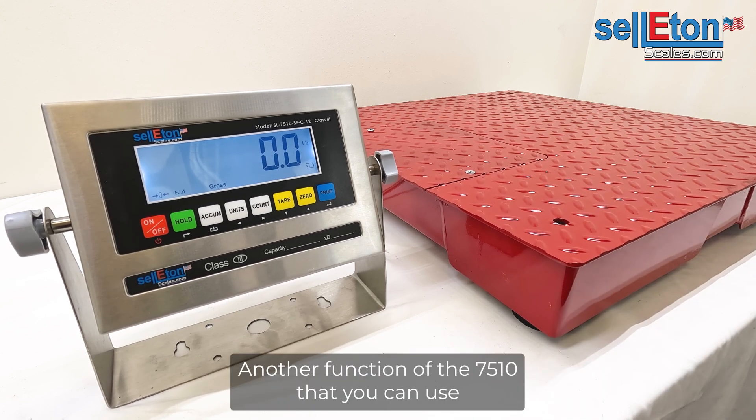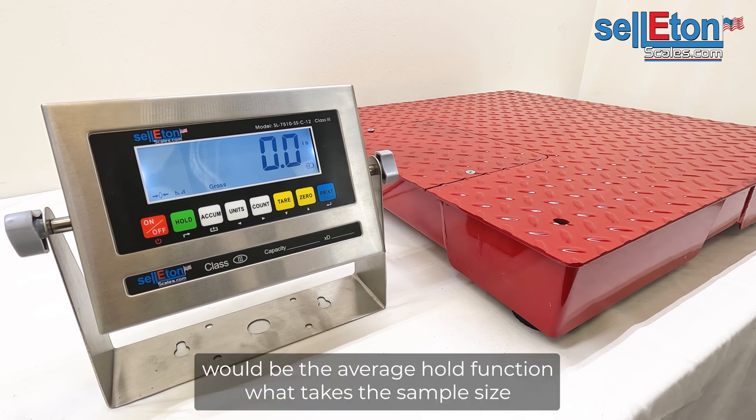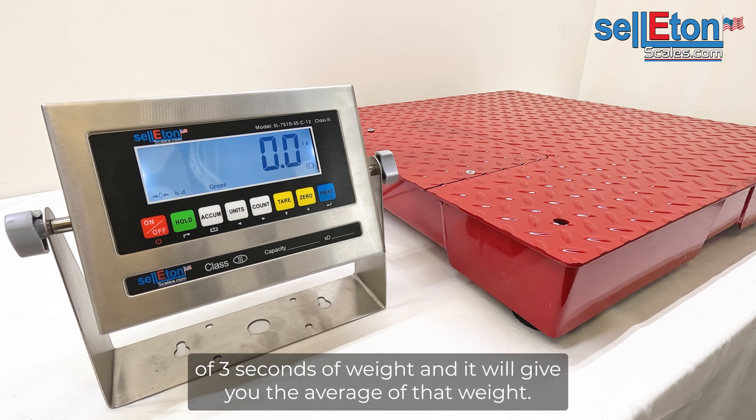Another function of the 7510 that you can use would be the average hold function. It takes a sample size of three seconds of weight and gives you the average of that weight.